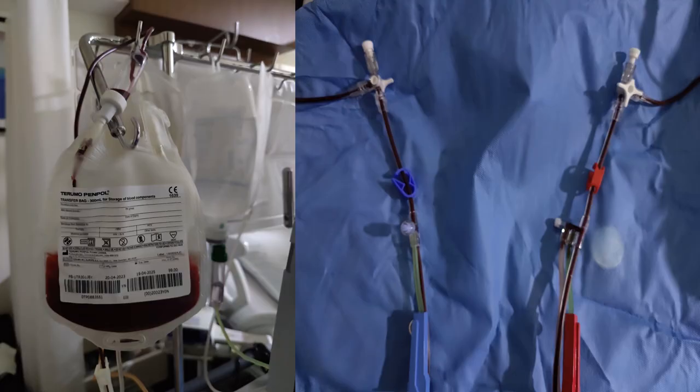Once the custom prime is completed, as we can see here, the PRC enters the centrifuge through the inlet line and the whole system is primed with the PRC. The outlet line is then connected to the transfer bag where we can see the remaining red cells collected.